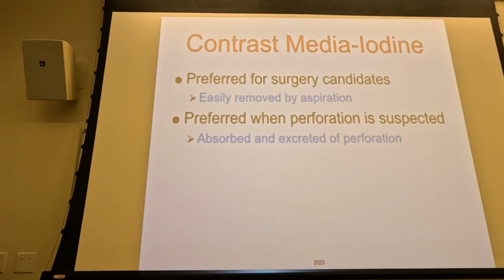An old treatment that they used to use a long, long time ago was to use extremely thick barium, in hopes that the barium would work like the stuff you put in a flat tire that inflates and seals the flat, right? They kind of use it like that. So they would put really, really thick barium into the patient, hoping that the barium would settle in the perforation and seal it up. They abandoned that procedure decades and decades ago. They don't do that anymore.